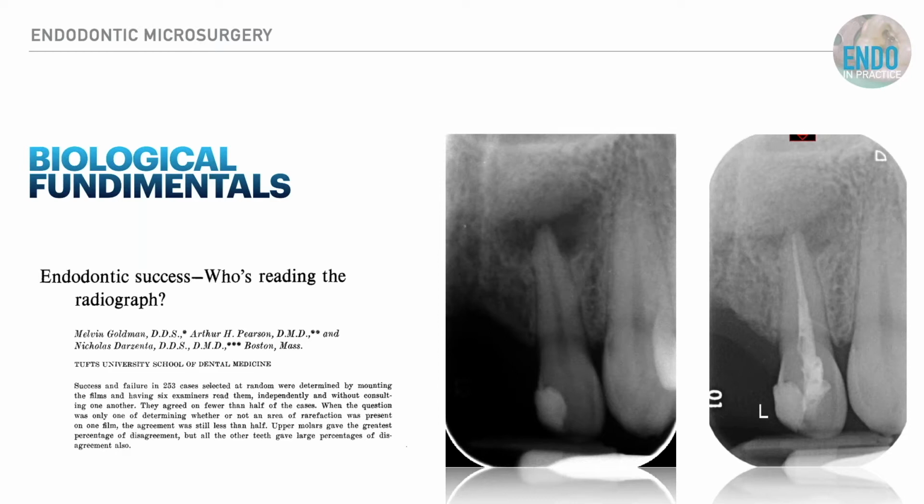And I think this is just another radiograph that really highlights this. A radiograph at a single snapshot in time really doesn't give you the full picture. Now, albeit you could say that that obturation doesn't look too hot, when you look at the pre and the post-op radiographs, you can see that there are positive changes in healing, such that, looking at either of those individual radiographs, you wouldn't have that full scope.